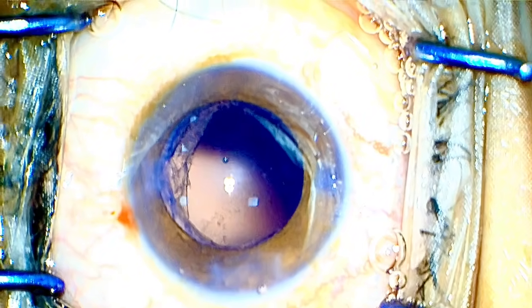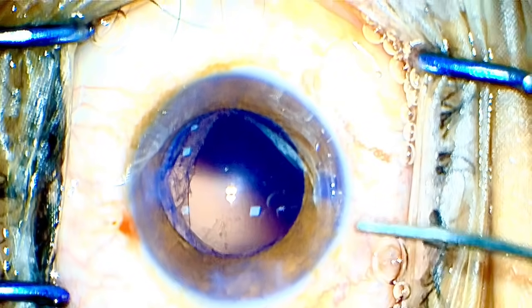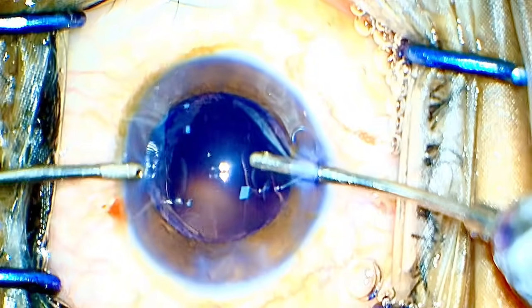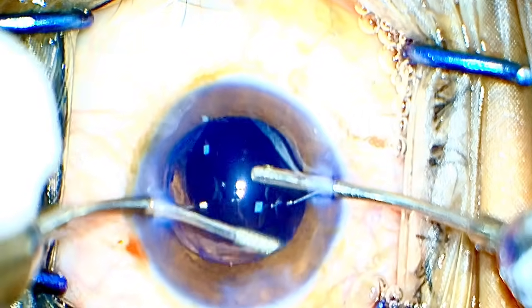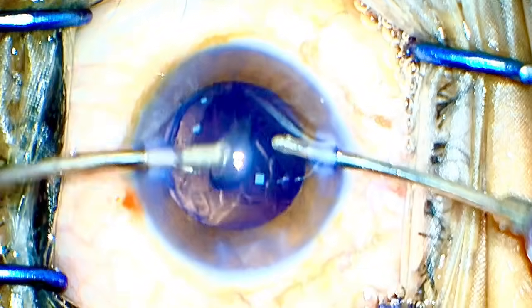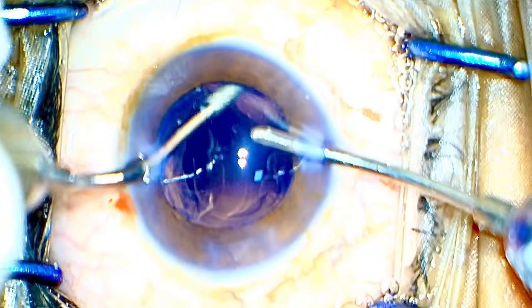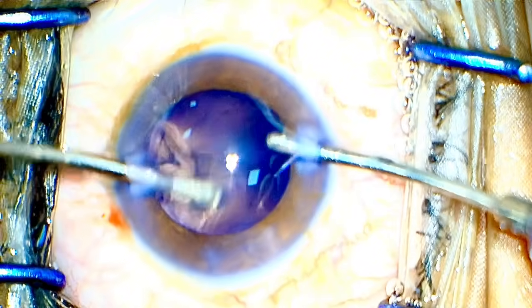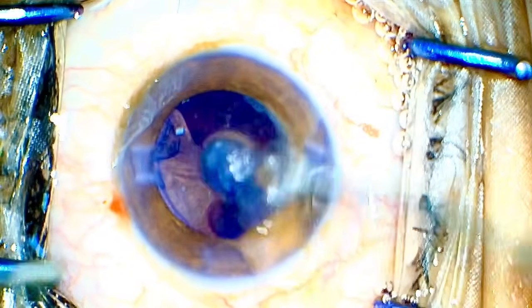So this is a very interesting fun case. You should go back to the video, replay it a couple of times, and notice what I have done. Simple case, 6 to 7 minutes of operative time. The patient was really happy. The patient was screened for NPDR earlier and he got a very good vision regardless.